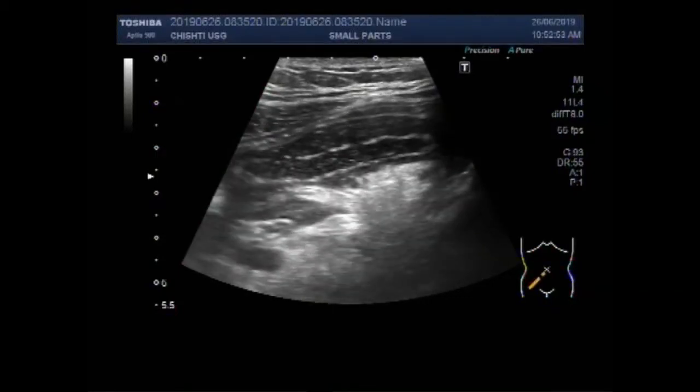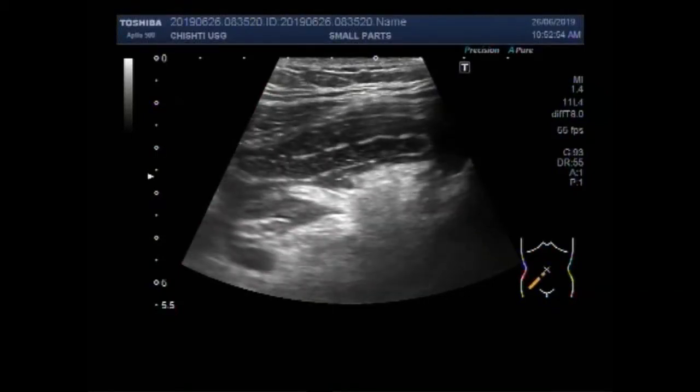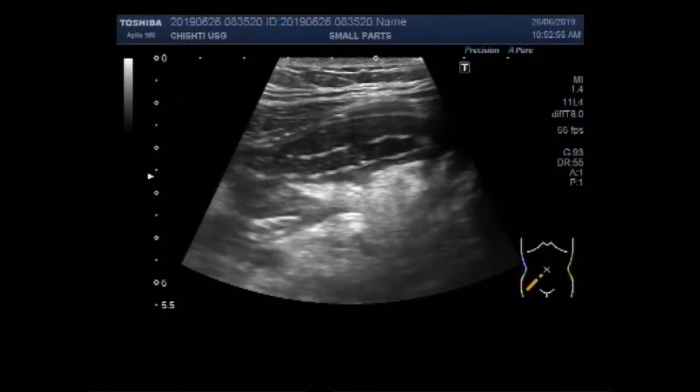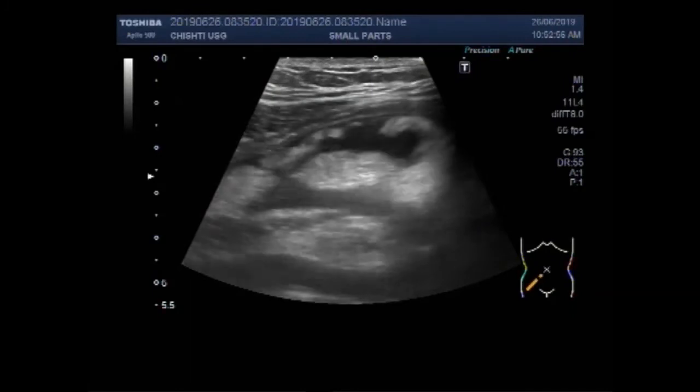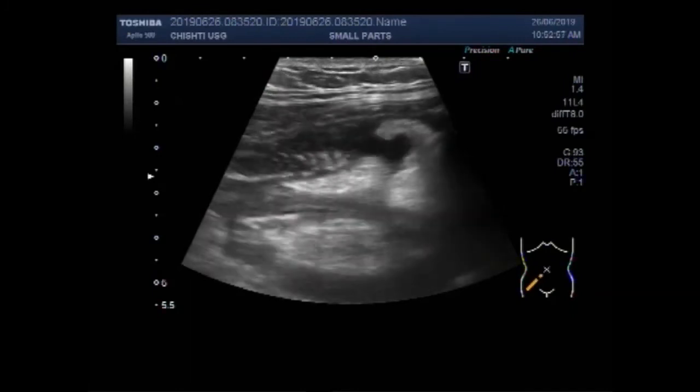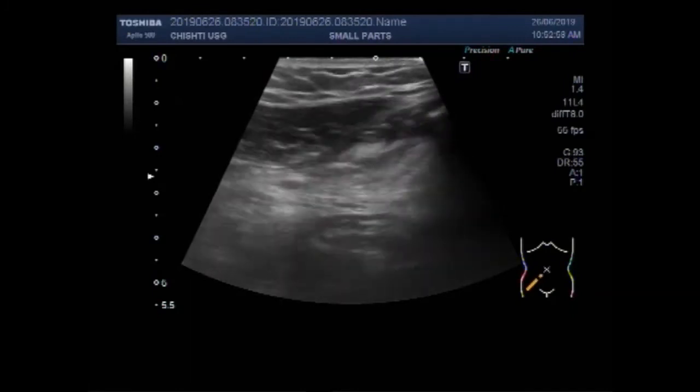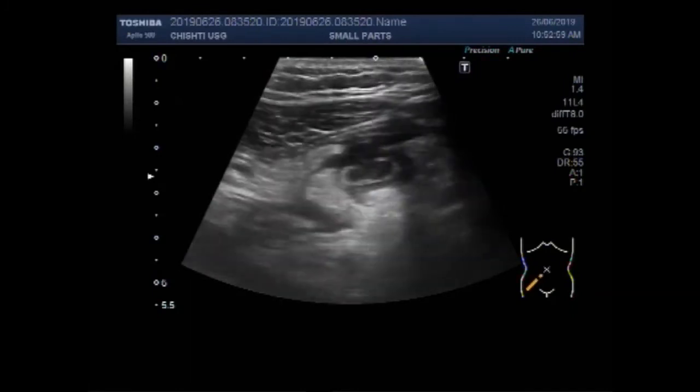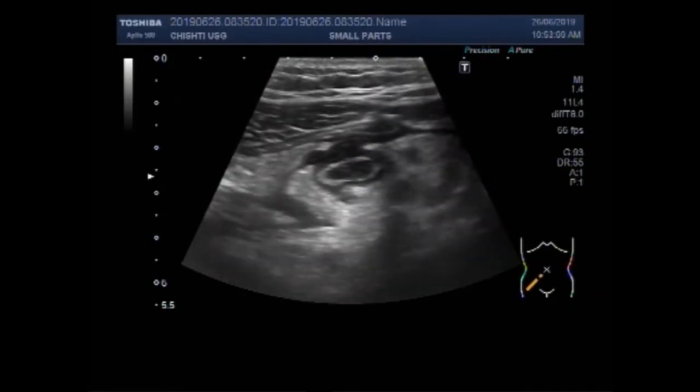Dear viewers, I hope you are all fine. This ultrasound video shows a case of acute appendicitis.